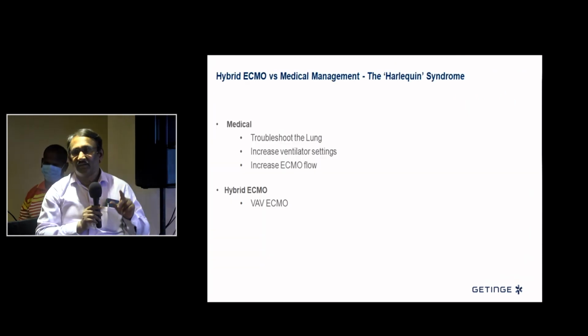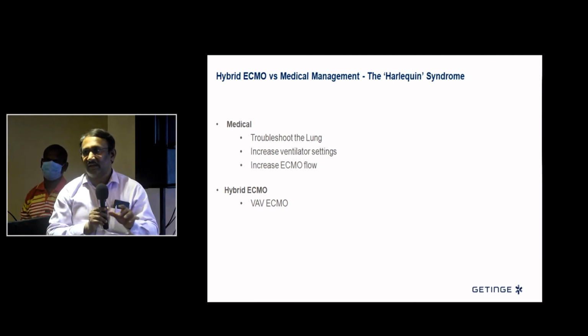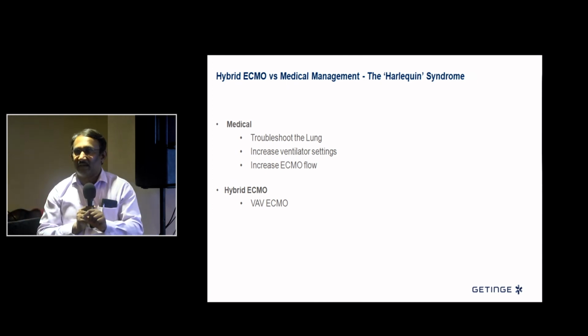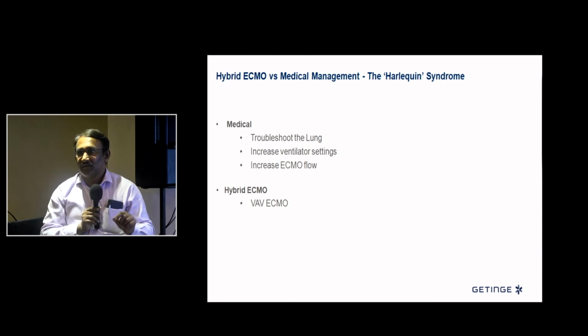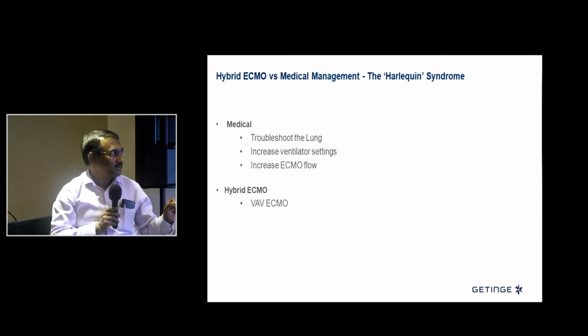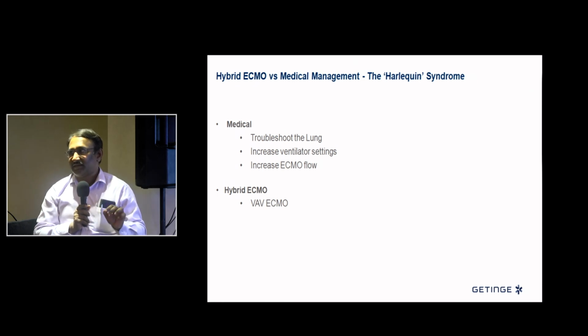It is common to see that because it happens that in the initial phase of trouble, like Veena said, you have LV distension, all these things, lungs will become wet. Then slowly the heart starts recovering, but it may happen that your lung has not yet recovered. So in that case, you see this, your lungs are not good, but your heart is still ejecting a bit. It is very important because this is the saturation which is going to the coronaries and cerebral. So for that reason, it is very important.